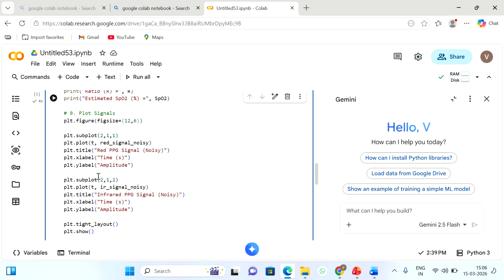In the second plot, two rows, one column, second position, the same thing is done for the IR signal. So time, comma, IR signal noisy. Plot the title infrared PPG signal noisy, with x label time in seconds, y label amplitude, and then tight layout. So each and every graph will be equidistant and located spatially with uniform space. So they are tightly fit, then the chart show displays all.